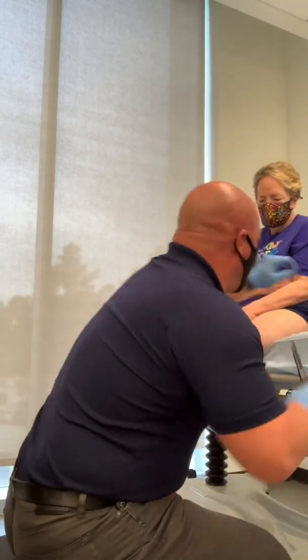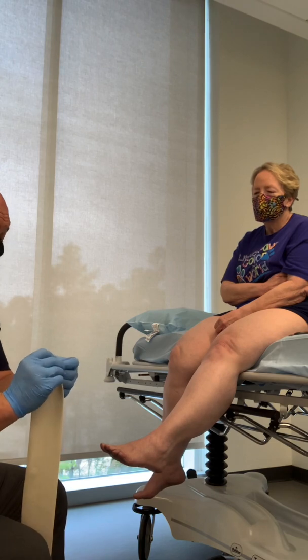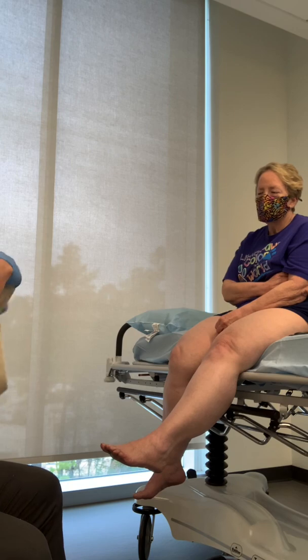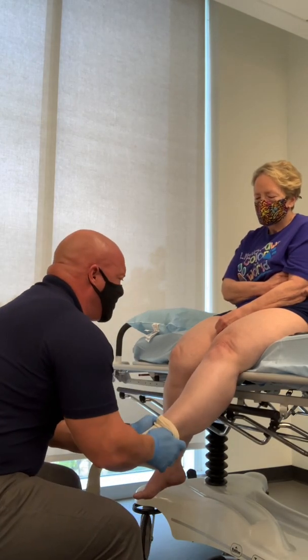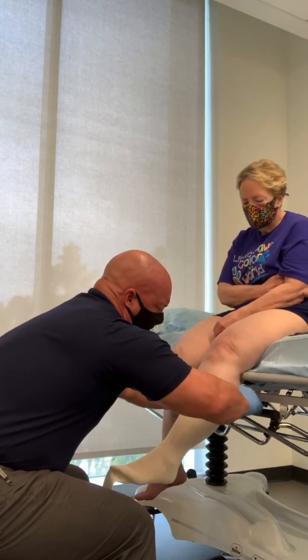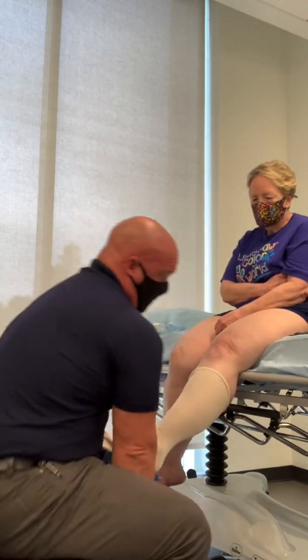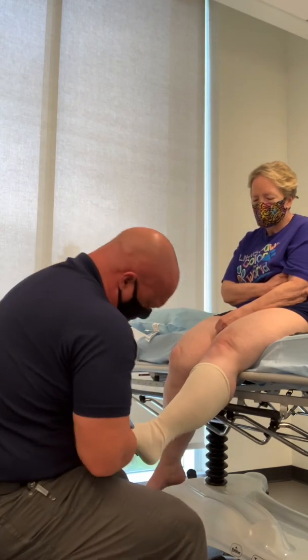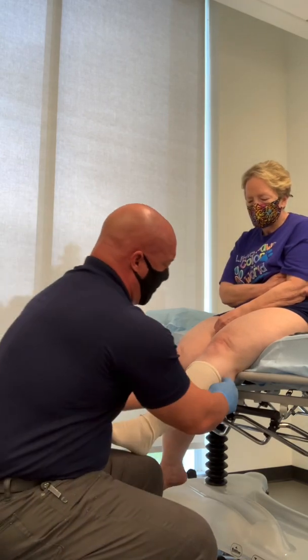Now, after that is done, just like you would put on a stocking or a pair of pantyhose, we're going to bunch the stockinette, come over the toe — just have to relax the leg. You can see this is already starting to get tight, so again we probably should use a larger diameter, 4-inch. You saw that I'm leaving some slack off the toe — we want to leave this here, that's going to be key in a few minutes.